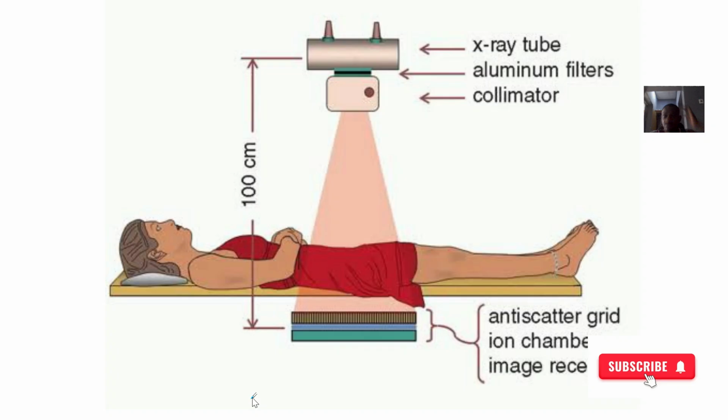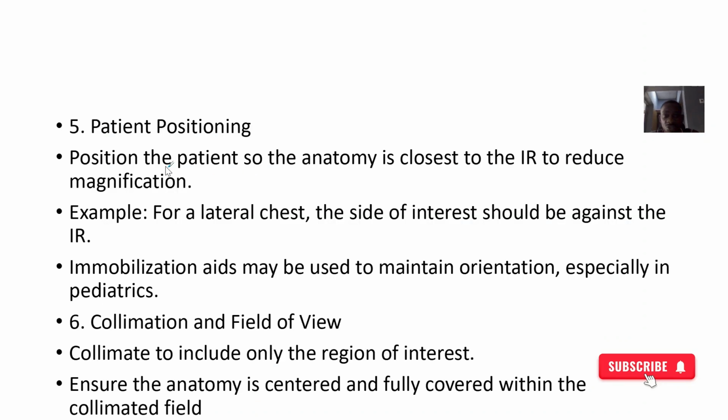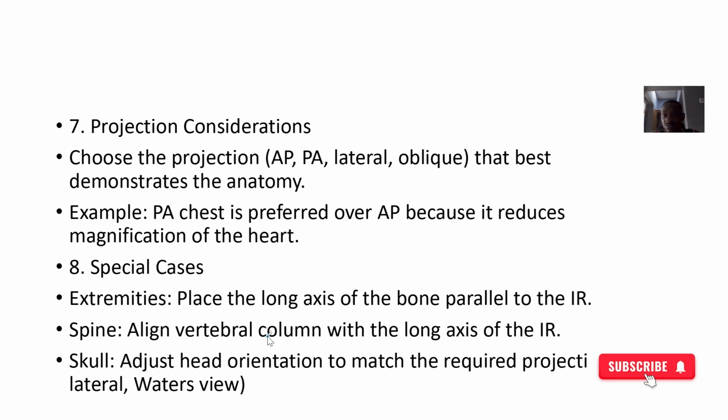Patient positioning: you have to position the patient very well so that you get the best result, and you have to streamline the radiation energy directly to the part where you actually need the imaging to be done. Projection consideration: you have to check whether you want the anterior posterior view, the posterior anterior view, the lateral view, or the oblique view.